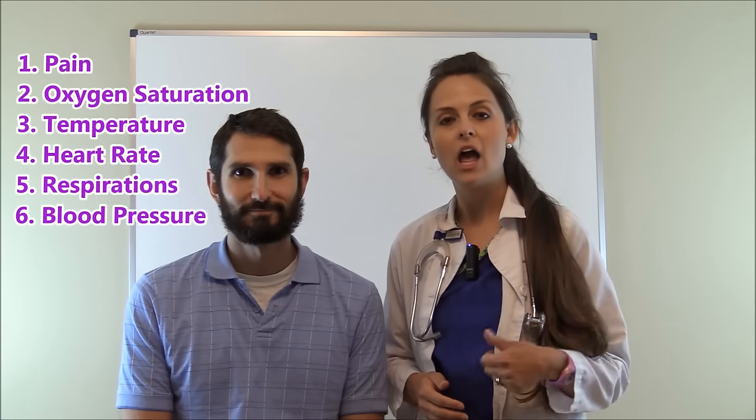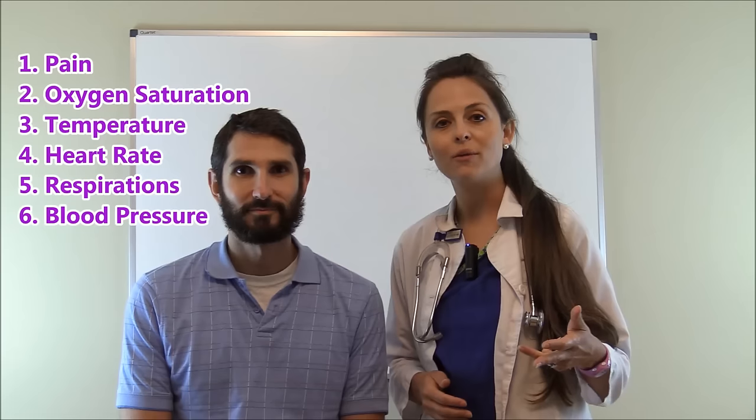What we're going to be doing is checking the six vital signs which are pain, oxygen saturation, temperature, heart rate, respirations, and blood pressure.